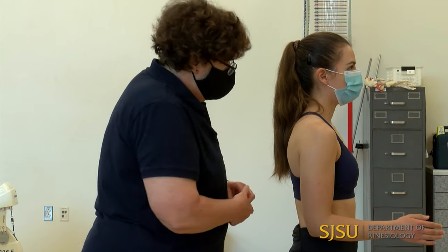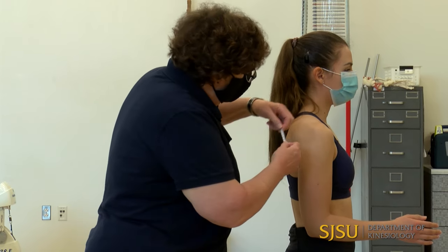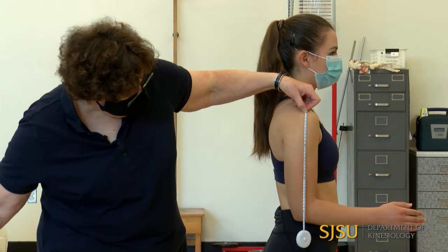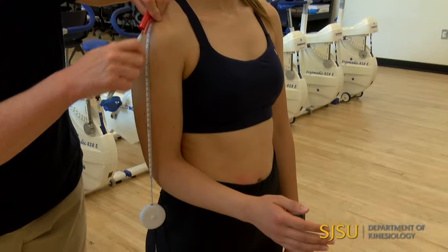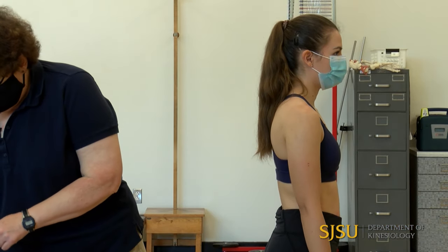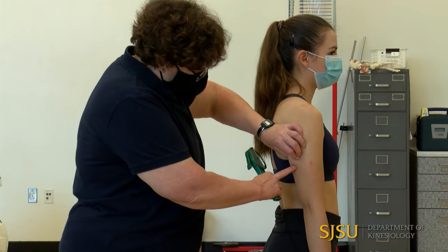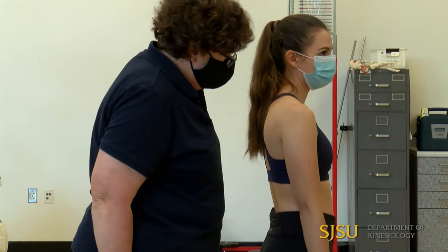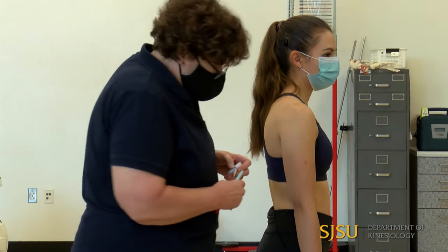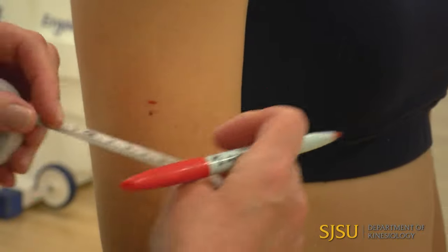For triceps and biceps, just like for the circumference, we measure midway from the lateral projection of the acromion process down to the olecranon process, measuring along the side of the arm. I get 34 centimeters, so the midpoint is 17 centimeters. When taking the skinfold measurement, the arm must be hanging relaxed by the side. For triceps, measure right over the belly of the triceps; for biceps, right over the belly of the biceps. There is no special Jackson site for these — they are exactly the same.